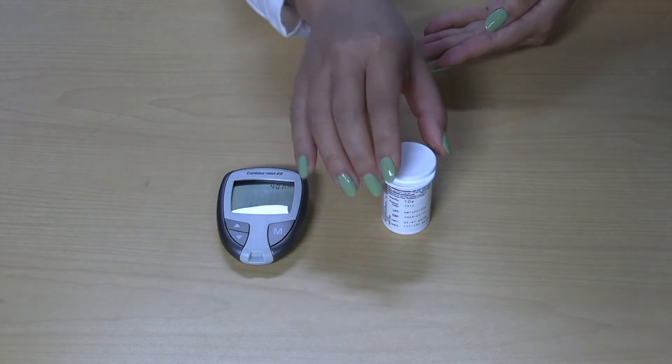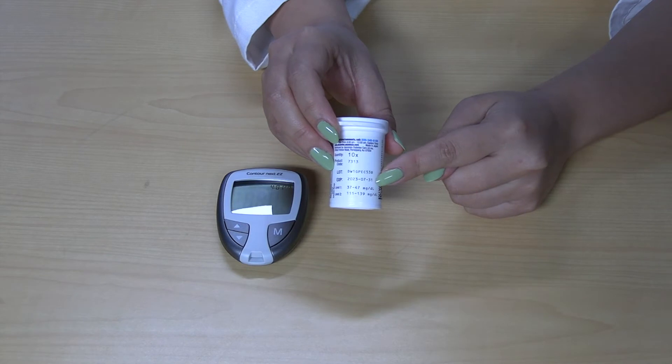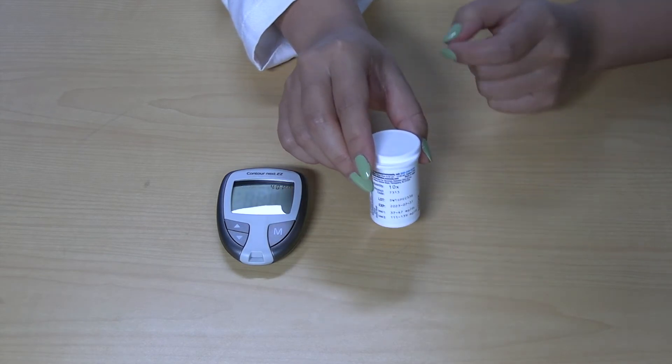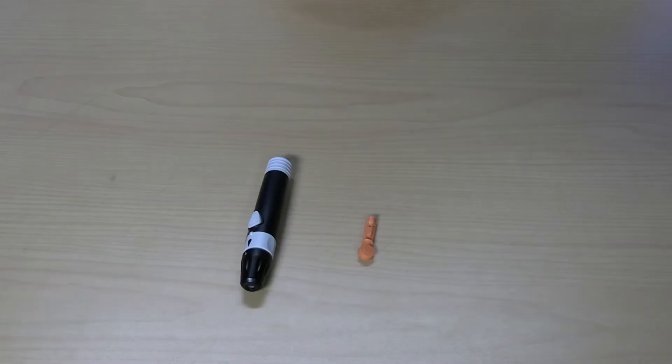Check the test strips container to confirm that the strips are not expired. Confirm that the batteries do not need replacing if the meter is not turning on. Before starting, wash your hands with soap and warm water, then dry thoroughly.